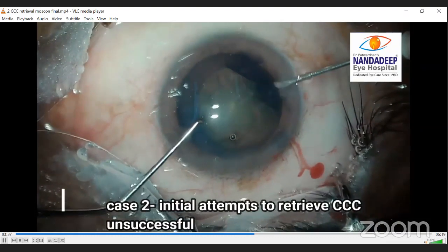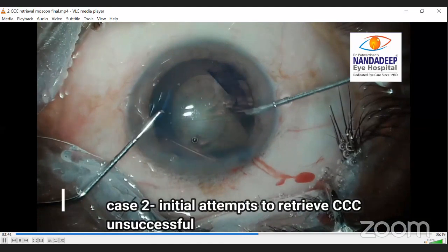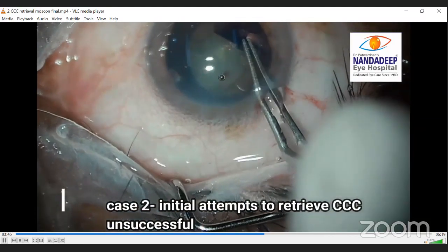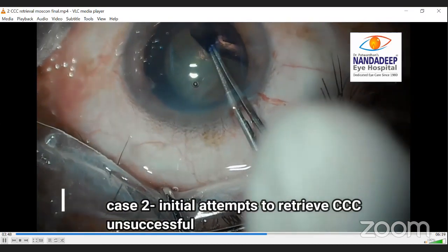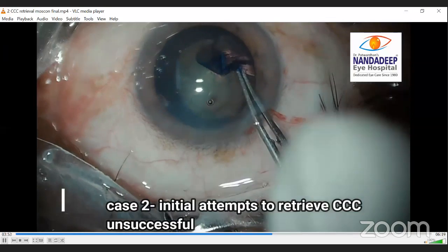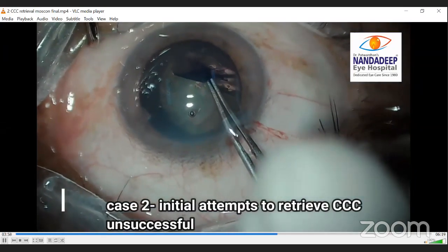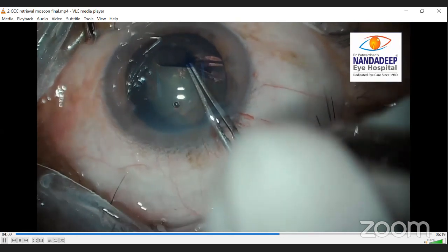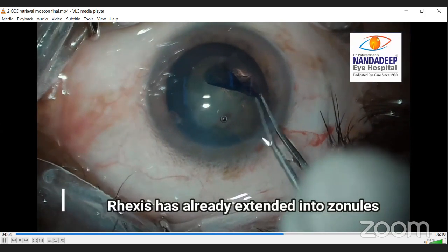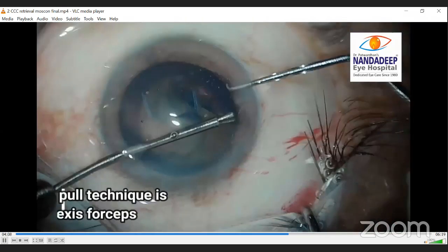So the rexis has already extended. The surgeon is trying to retrieve it initially with little maneuver, and now he's trying to do quick pull maneuver, but see his force is tangential rather than central. You can see here he's still trying to pull it tangentially, then it is not of use. So in order to make it work, you have to go from the opposite side and then pull it centrally very firmly.